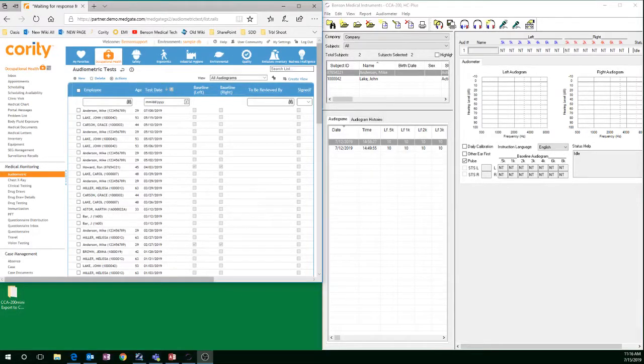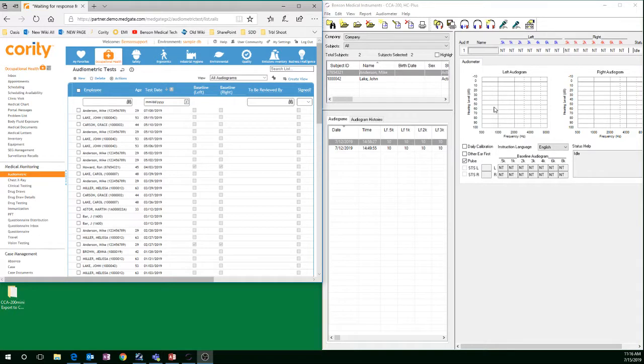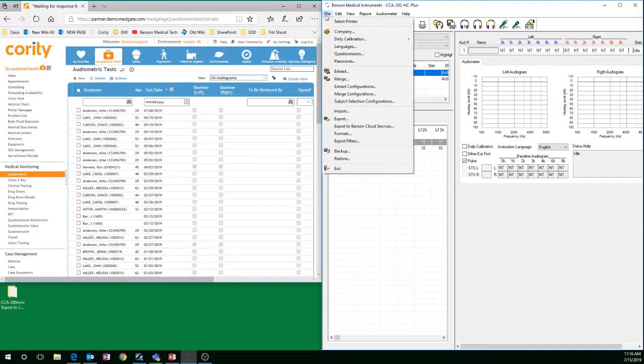To go from CCA 200mini software into Cority using our export feature, go to File, Export.